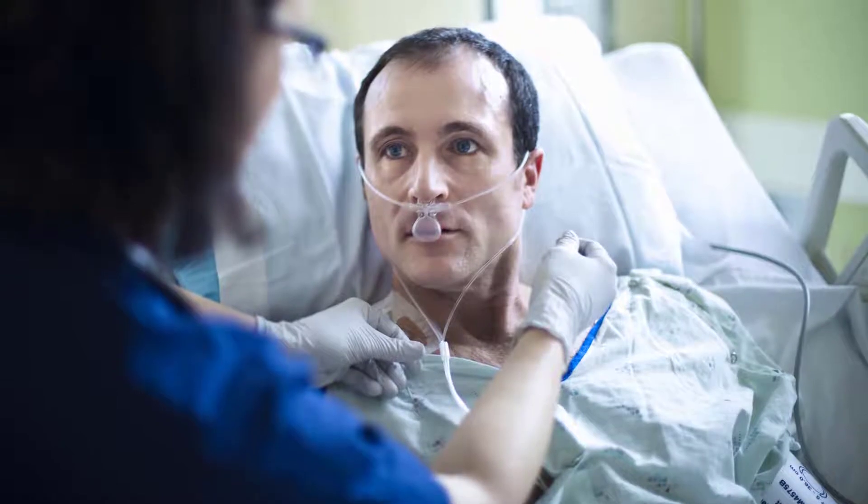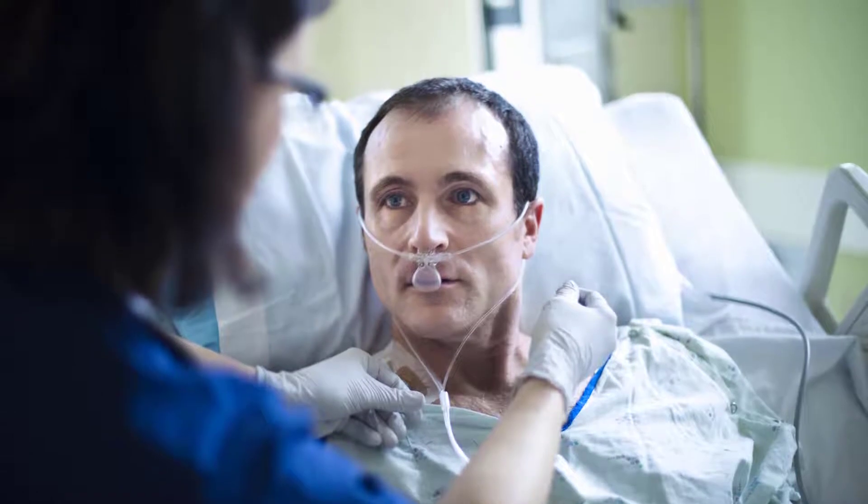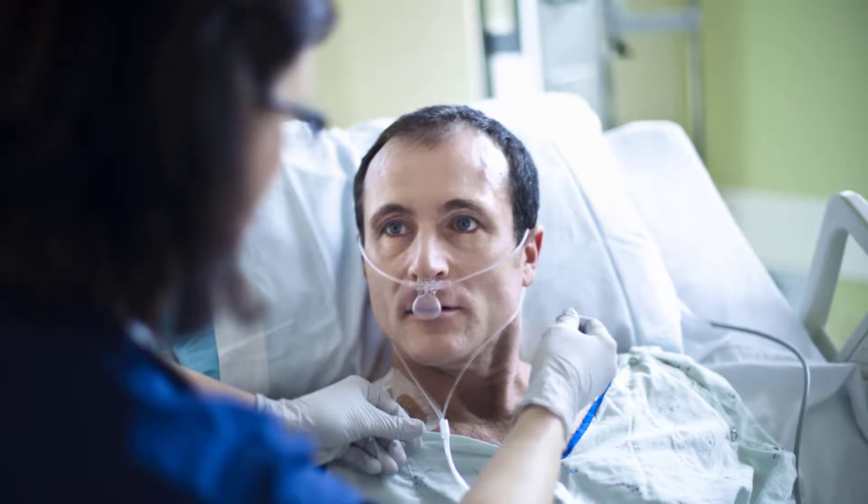Welcome to the Philips Intelliview patient monitoring microlearnings. In this session, I will talk about measuring carbon dioxide, or CO2, with our patient monitors.